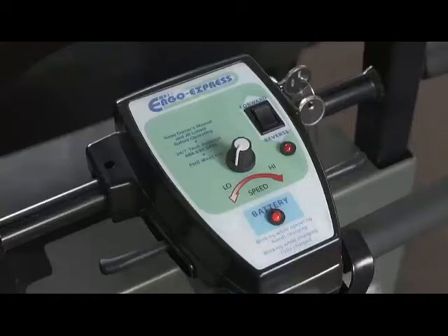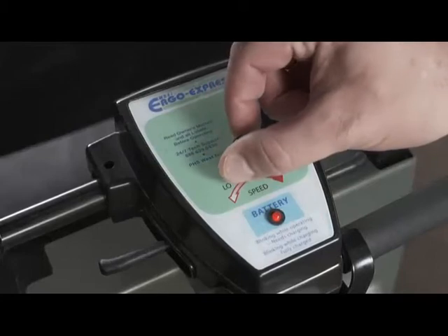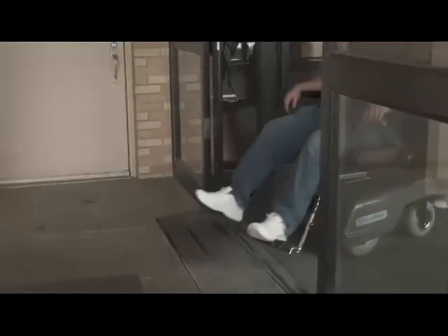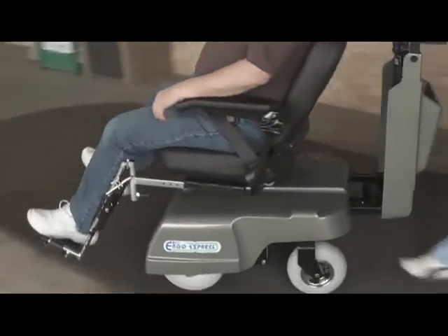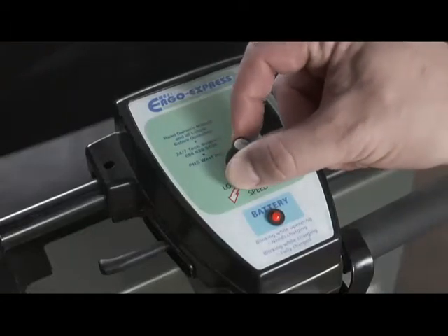Change the top speed control a few times to become familiar with its operation. Try operating the PTC at both its minimum and highest level. Use the minimum speed in tight areas, elevators, and high-population areas. The top speed control can be adjusted while the PTC is in motion.